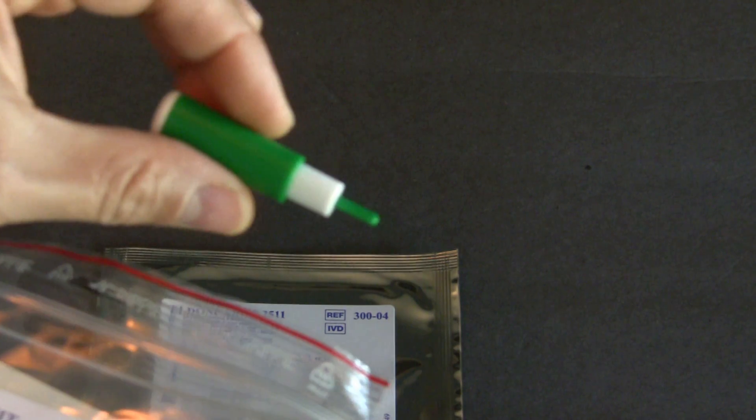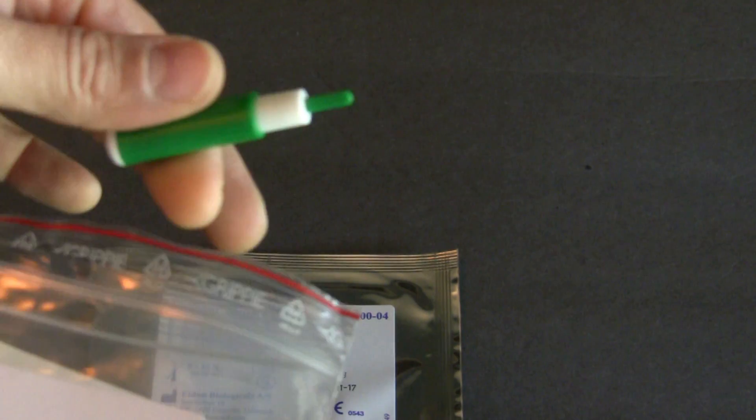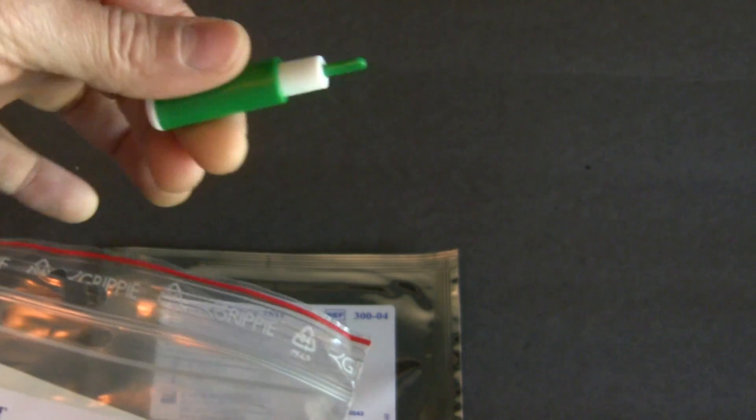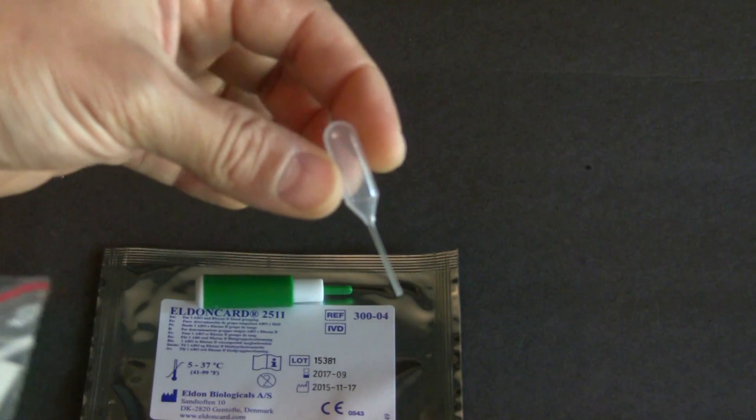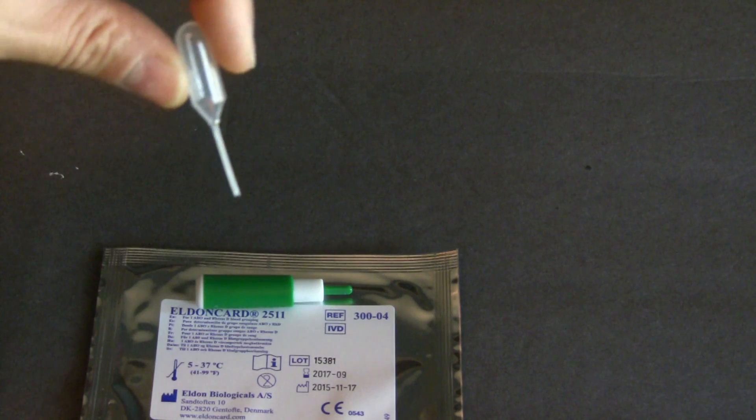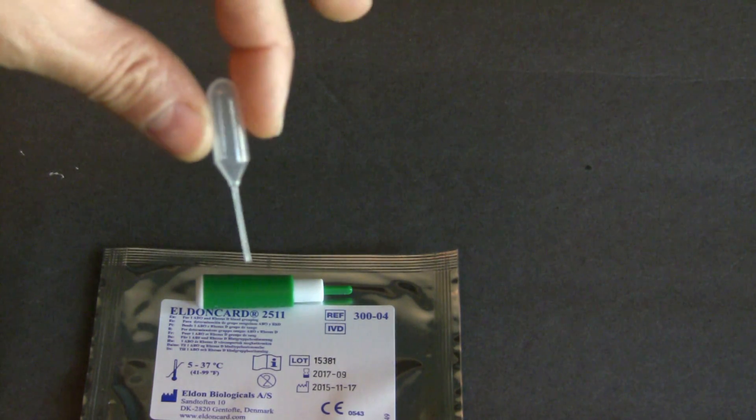Comes with the lancet, that's what you're going to prick your finger or your ear with. It also comes with this little pump, you're going to use this to drop water onto your Eldon card.